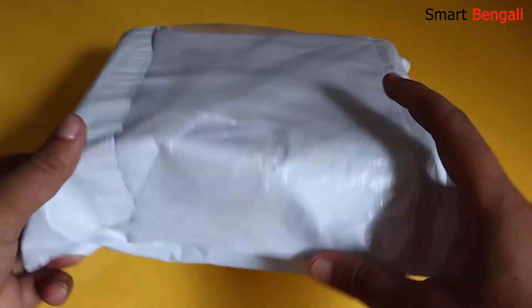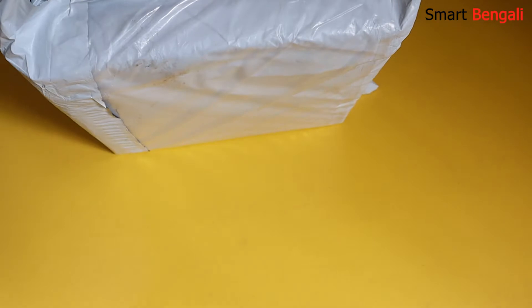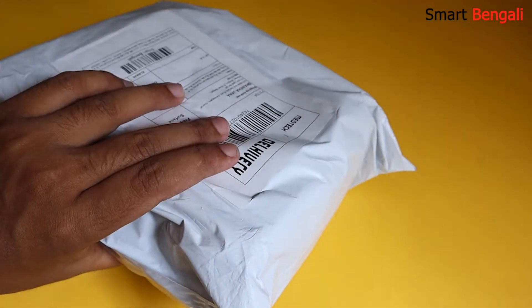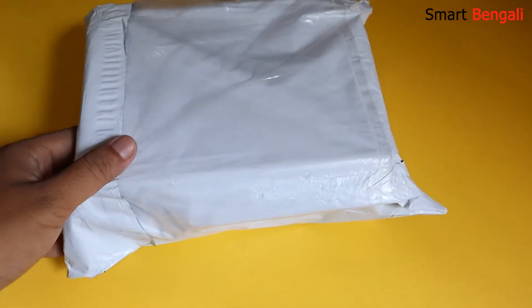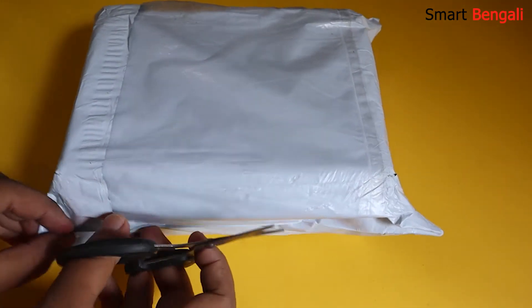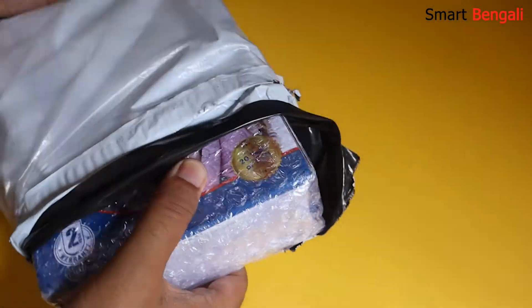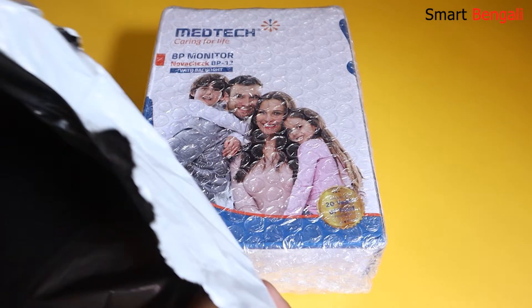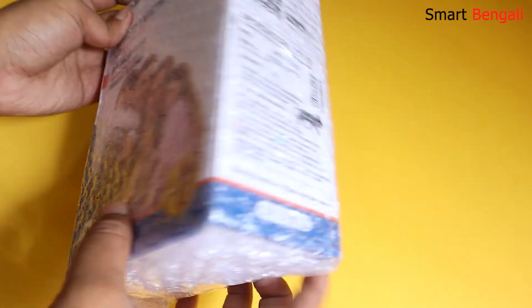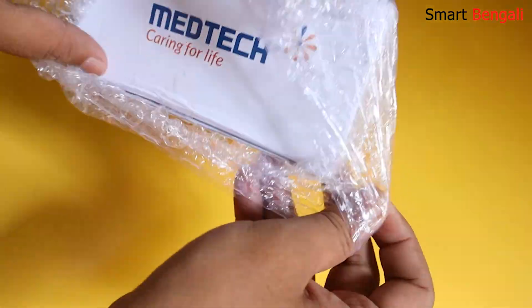So this is the package — very neatly packed. It was sent via delivery courier and it took just a couple of days to reach my place. So let's open it. We have nothing else inside this wrapper.